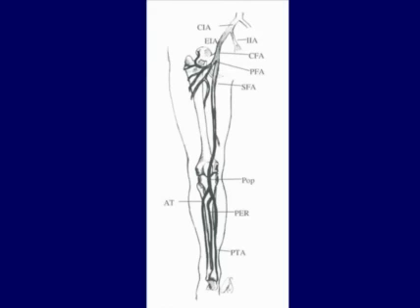What areas do we look at? When we do the lower extremity arterial ultrasound, we pretty much start right about here, right at the groin crease, which is just below the inguinal ligament, and this is the common femoral artery. Depending upon what we see in the common femoral artery, we may want to extend the evaluation further north to include the iliac vessels as well as the aorta.